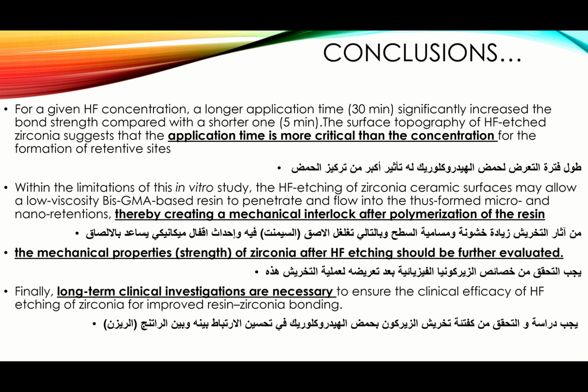because you're talking about, you know, even LTD, low temperature degradation. The problem of low temperature degradation is surface roughness and then micro cracks. Okay, there is a transformational toughening, but that doesn't mean that there are no cracks. There are surface uplifts and they will cause micro cracks, and yes, there is a stopping and hindering mechanism of the crack propagation, but there are cracks on the surface.